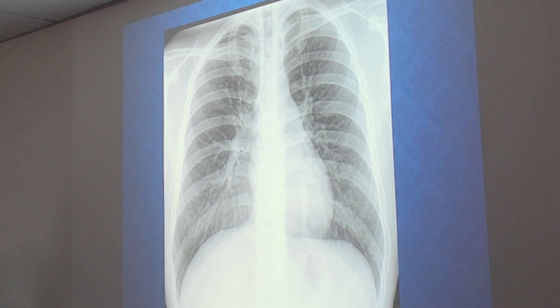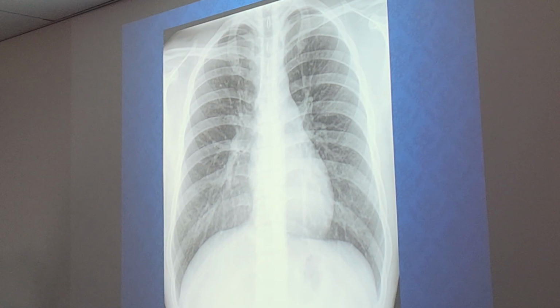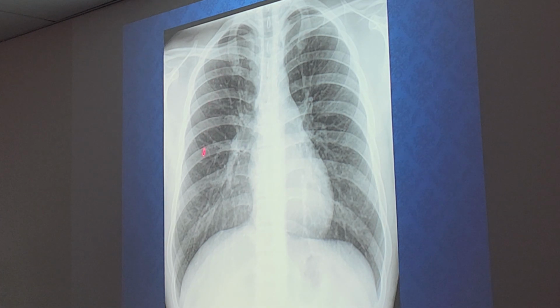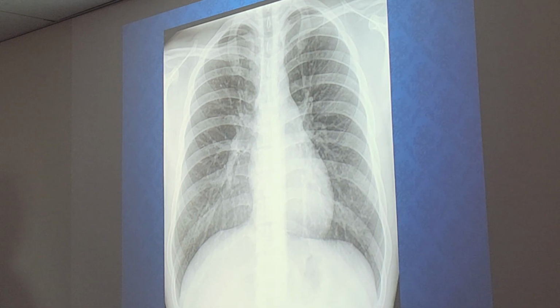So other than the ribs, can we just go based off of the clavicles? To decide AP or PA, you need multiple things. There's something else other than the ribs and the clavicles. Ms. Bonilla was hinting at this earlier. The scapulas? Yes. In a PA position, remember we do the chicken wings? What do the chicken wings do? It moves the scapula away from the lungs. So if you take a look at this image, the medial border of the scapula is not in the lung field, correct? It's out here. So that is another good clue that tells us it's PA.